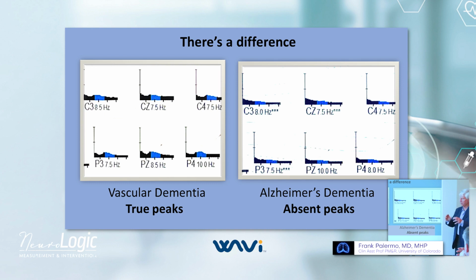Yeah, so for the doc who turns out had some vascular impairment, vascular dementia, this is his scans here. So you can see that there are bumps. Now that's at 78 years old. And this is the 73-year-old who had real dementia, right?